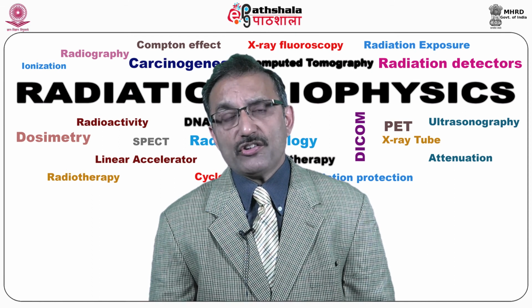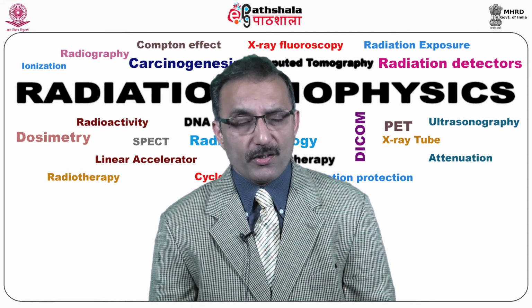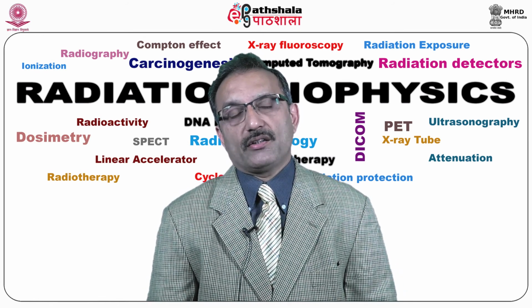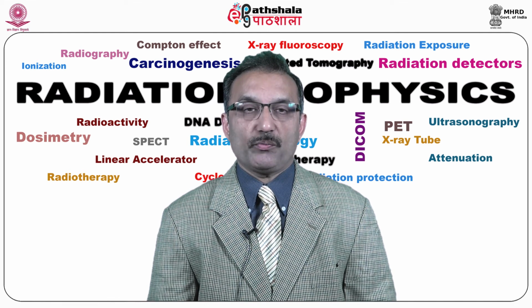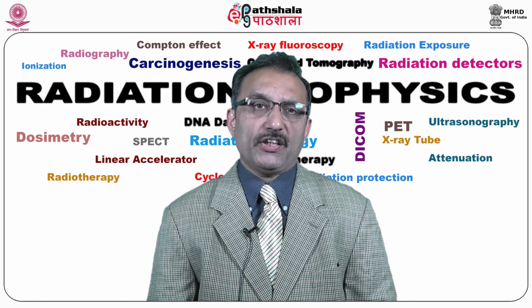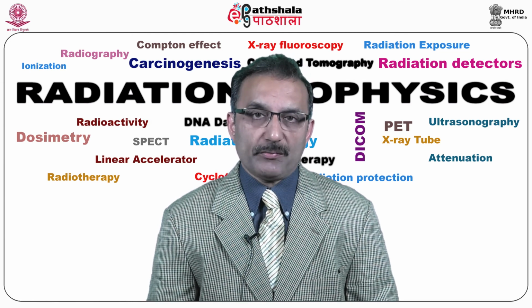So the acquisition time is also very, very important, but we have to see the patient comfort also, when the patient is on the couch, how we can make him comfortable. Those are the two important aspects to be seen. Sometimes the protocol says that the patient has to be there for this much time, for this much activity to be administered. But again, acquisition and activity depend on many factors, like a child patient, a pediatric patient, or a bulky patient, in such cases how much activity is to be administered.